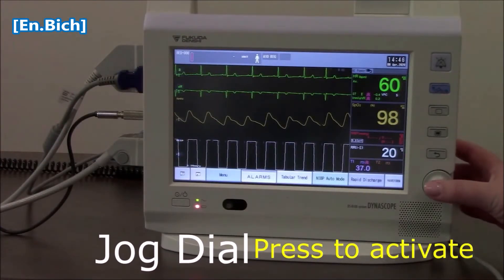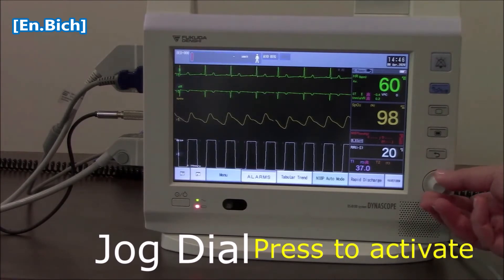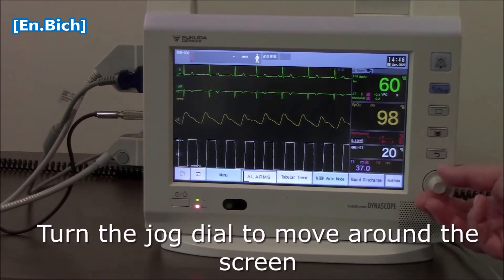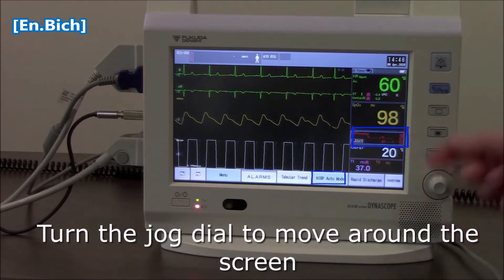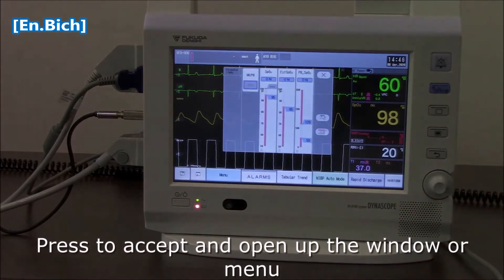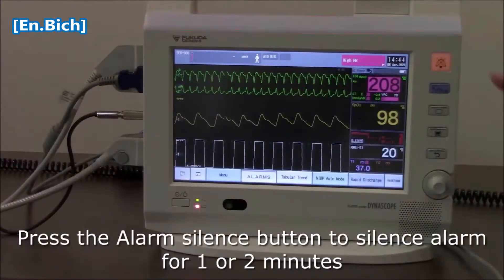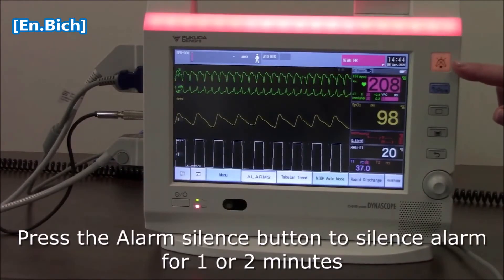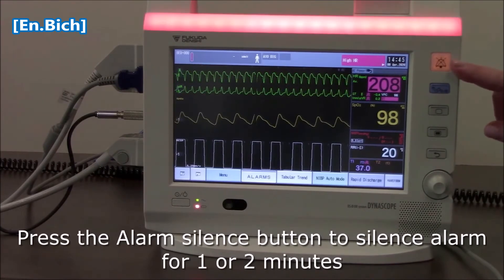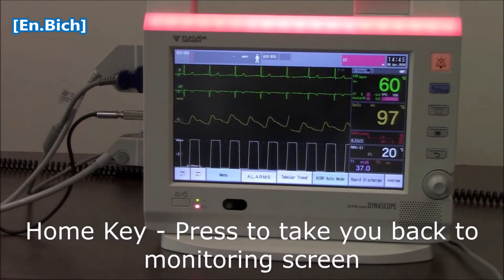We also have a little jog dial here. Press to activate it — you'll see that it will highlight in blue along the bottom, moving through those user keys, then through the parameters. It highlights in blue; press to accept and it will open up whatever parameter. You can see that the alarm silence button has been highlighted to show it's been activated, and that will silence the alarm for one or two minutes.